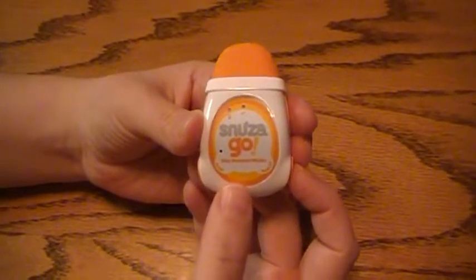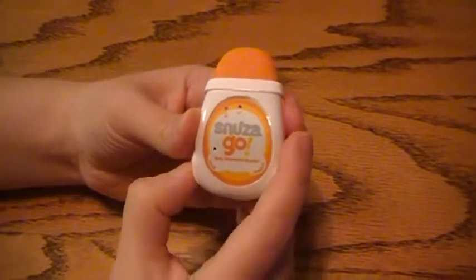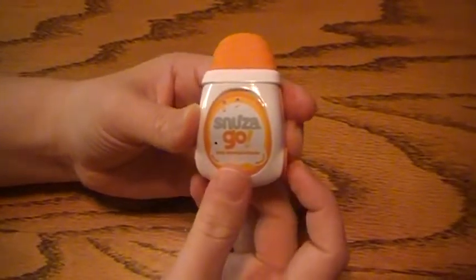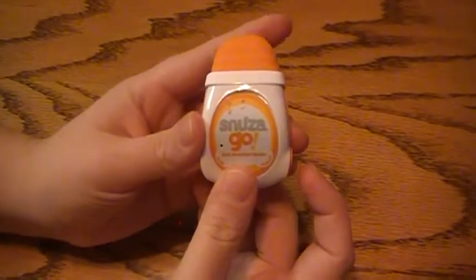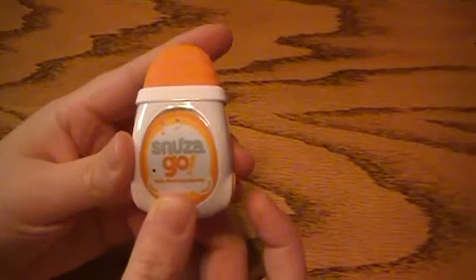I'm going to show you how to program the Audible Tick function on your Snuza Go. For this, you want to start by turning the monitor on. I did a quick battery check. And now, when it detects movement, you can see the light just flashes. It's a silent monitoring setting.